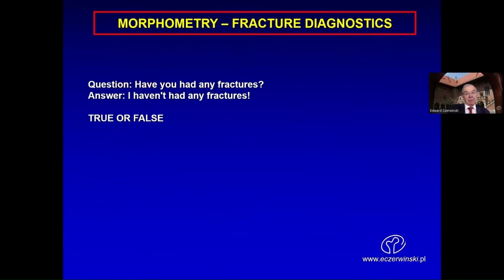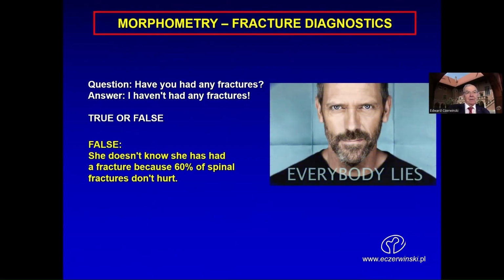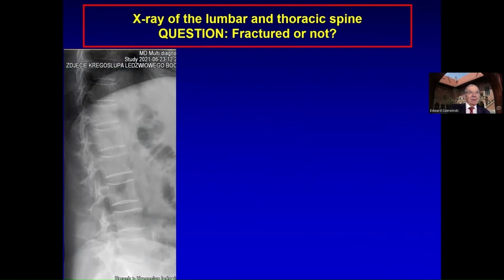If you ask a patient whether she has a fracture and the answer is I have no fracture, you don't know whether this is true or false, because 60% of fractures don't hurt. So the next question should be, has your height decreased? But if she is on a DEXA scan, we measure the height, usually she doesn't know, but you have to inform her. So we do X-rays for fracture detection.